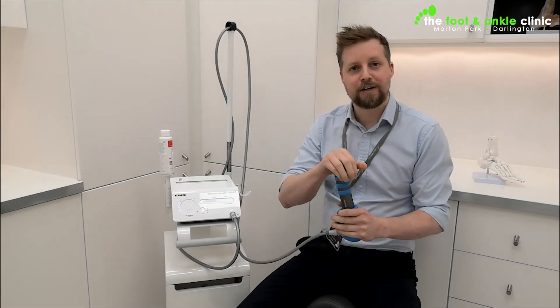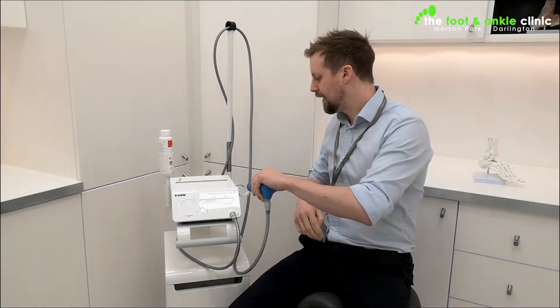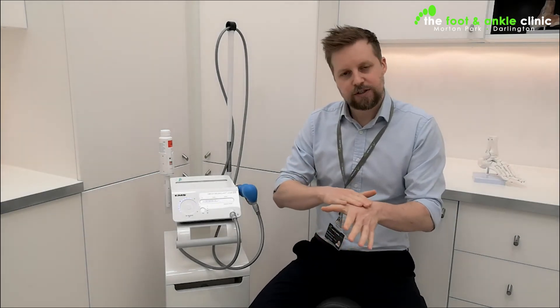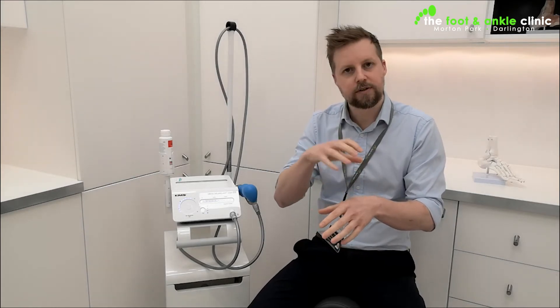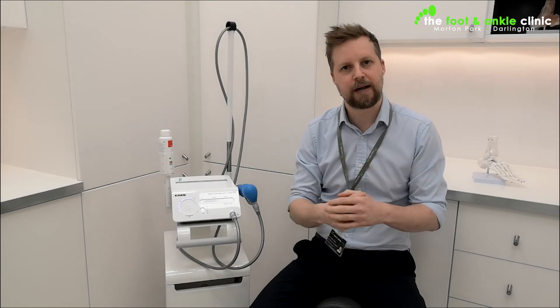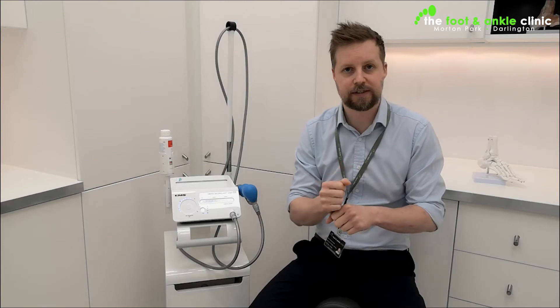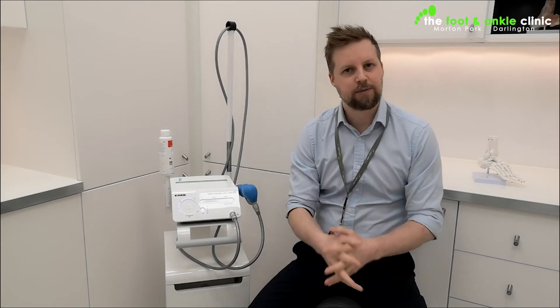Surprisingly, that one is a lot less uncomfortable than the first one, but that's just the way it works. Once it's applied to the skin or the soft tissue, it causes something called a cavitation. As that ball bearing comes up and down and hits the skin, it causes these little shockwaves to move out into the soft tissue. It creates a small level of inflammation in that area, which starts to speed up the healing process and get people out of pain. It does give you a numb sensation after having it done, which, if you had discomfort, is fantastic.